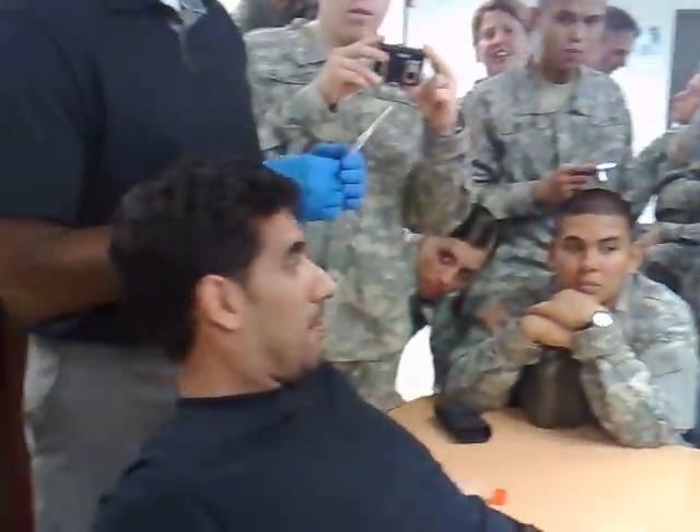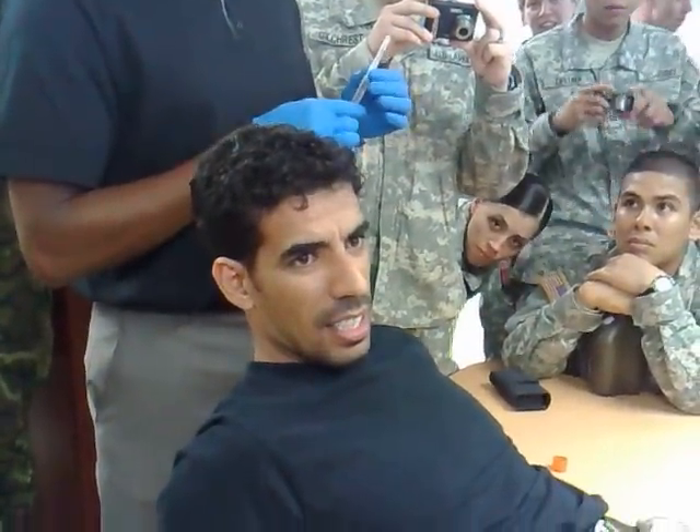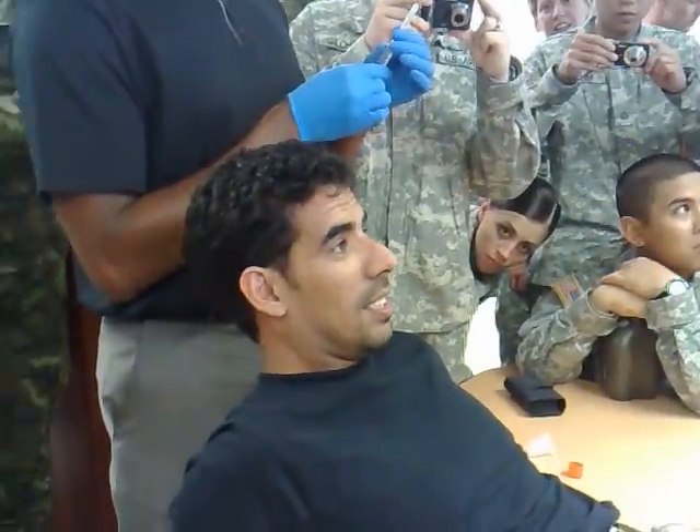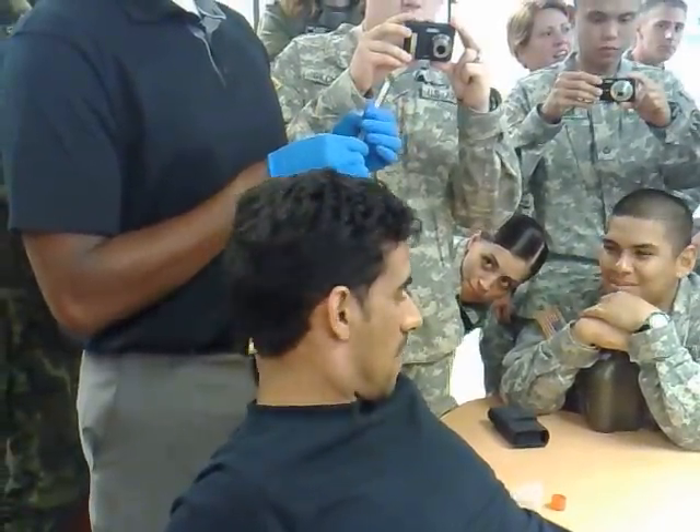Listen up: when you flush, you will have to draw your flush up with the needle. Before you flush, you'll have to remove the needle — it won't flush with the needle in place.